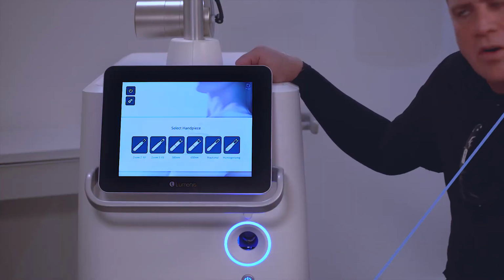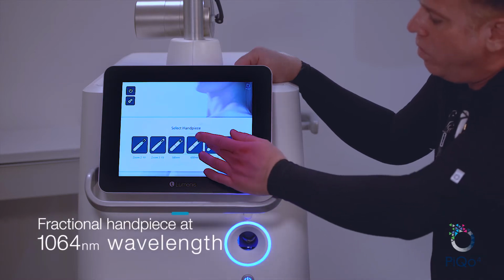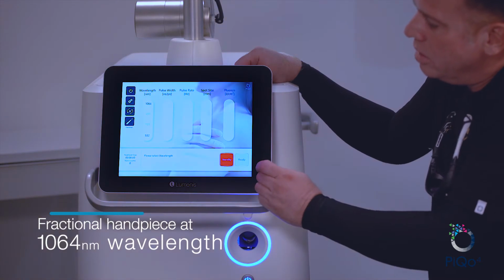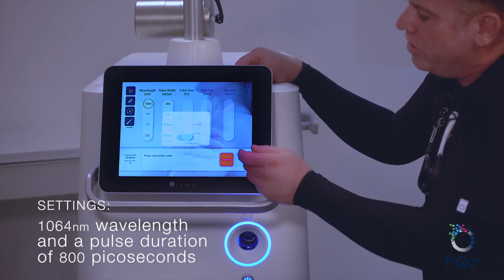When treating with the PiCo4, we have 6 available handpieces. For today's treatment, we're going to be using the fractional at 1064. When we come to the screen to set the settings, we set 1064. We're going to be using 800 picoseconds.